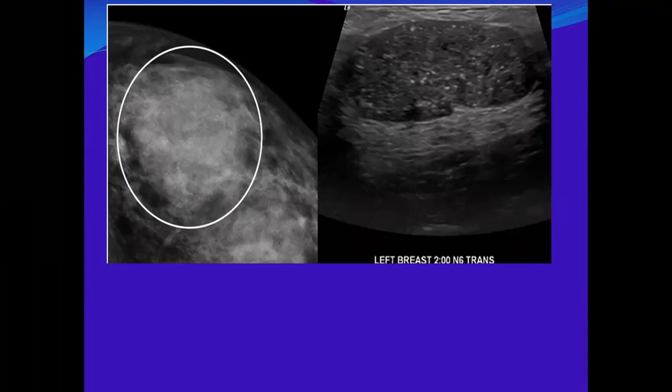Is it indistinct on ultrasound, this mass? If you say this area is indistinct, I cannot guarantee 100% that it is indistinct, because it is not at the center of the probe. I need to angulate and see these areas with different angulations.